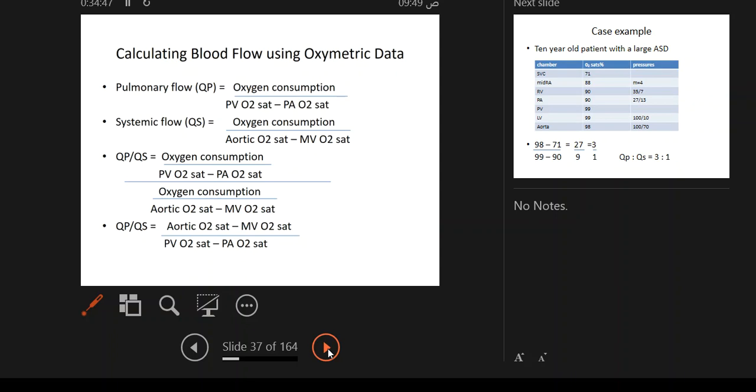Very simple. So there are many Cath labs in the world now that are hybrid. A hybrid Cath lab with an MRI machine. So the patient is on the same table, and the table goes from the MRI to the Cath lab. He checks for his cardiac output in the MRI and then goes to the Cath lab so he can finish doing his cath. It may be an intervention, most probably. Of course these are expensive machines. To have a hybrid Cath lab is very expensive. You have an MRI for several millions, you have a Cath lab for several million. Of course that's a lot of money for countries like ours. Not easy. Okay.